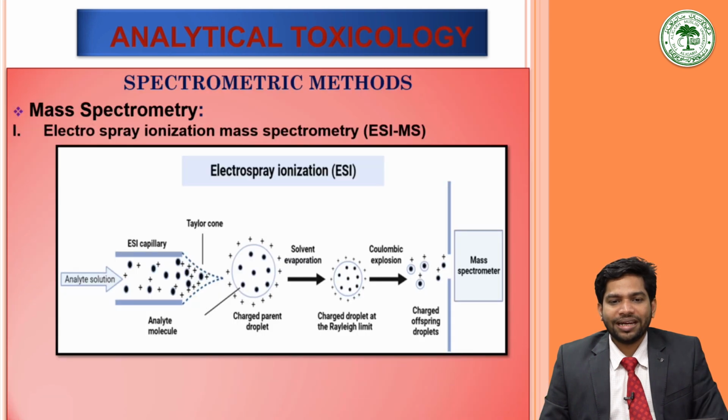Then, as we already talked, the ionization process can vary. Ionization can be done by chemical methods, or by electrospray ionization. Accordingly, the name of the mass spectrometry will be chemical ionization mass spectrometry, or electrospray ionization mass spectrometry. So this electrospray ionization mass spectrometry is a recently developed technique, especially useful in analysis of macromolecules, because it overcomes their propensity to fragment when ionized. For its development, John Bennett Fenn was awarded the Nobel Prize in Chemistry in 2002.